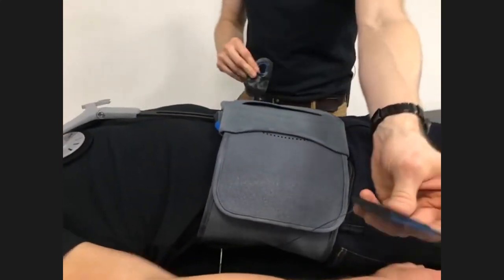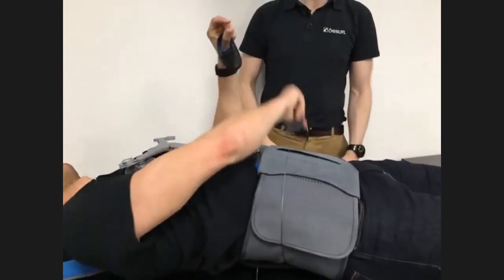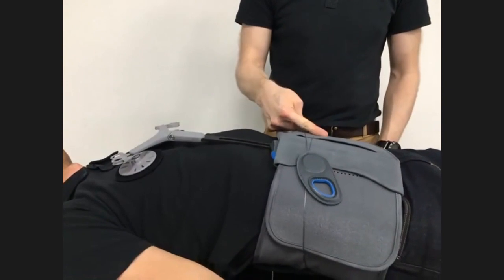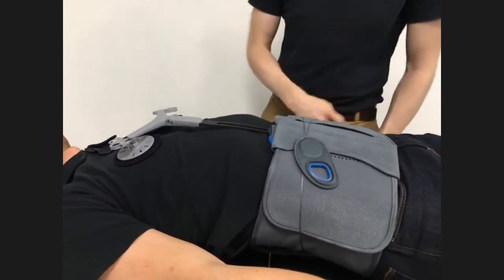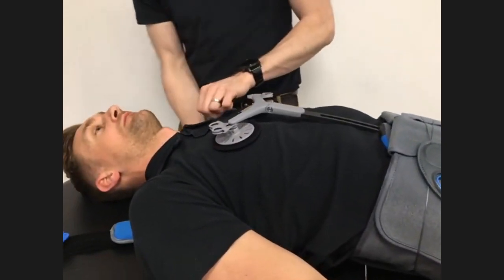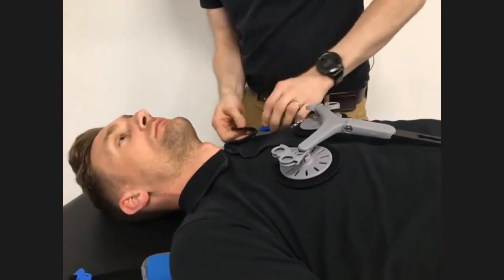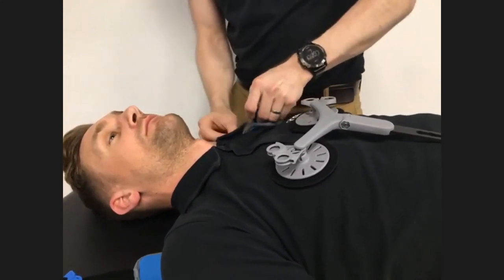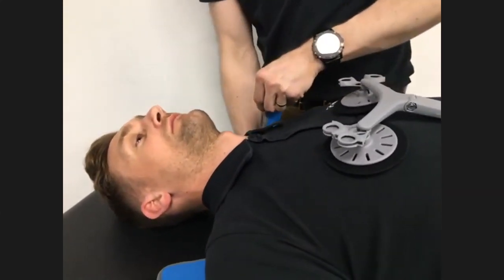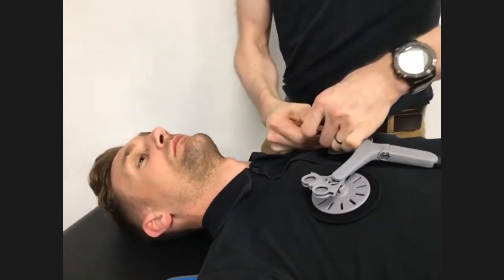So I'm going to give these two to Pete with the integrated thumb holes, place that through and pull out laterally and then fasten that over the top. In this case, these ones are quite long, so we would then adjust these to bring them back to the center. Okay, so we're now going to adjust the over the shoulder straps. I'm going to make a quick adjustment to this. This one's actually quite short. So just going to make a quick adjustment to bring that into position, and then we're going to clip this into position. Now I just need to make a small adjustment posteriorly. That's great, and then clip that one in.